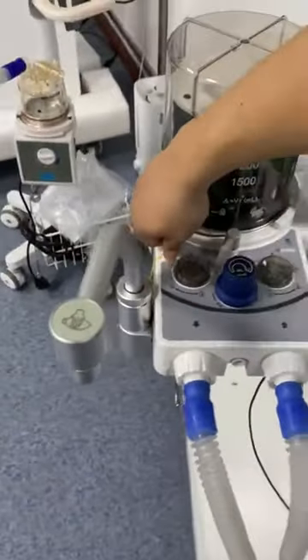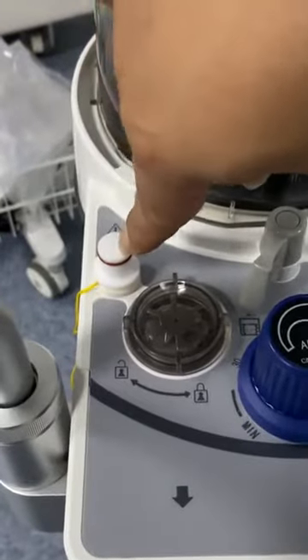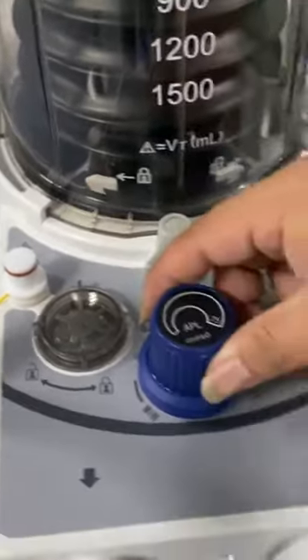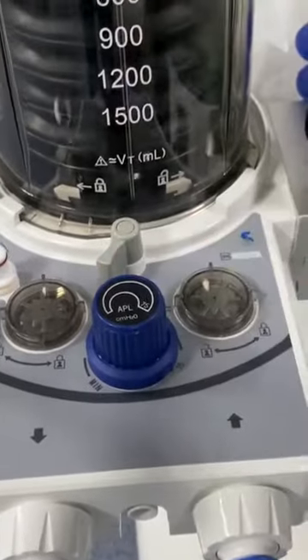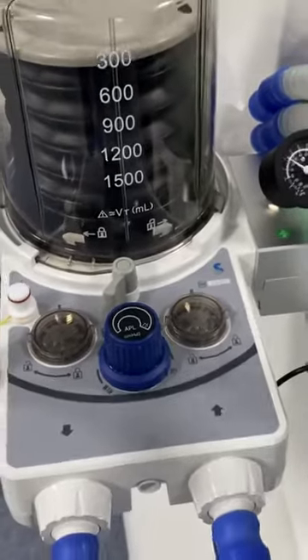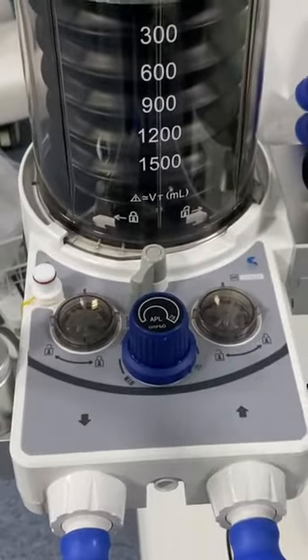Here, this port. Once we take this out, we can connect the oxygen sensor, so it can monitor the oxygen concentration. And this one is the APL valve. After the operation, if there is still gas and pressure inside the pipeline, then we can turn the APL valve to leak the gas out, and then the machine can be at rest.